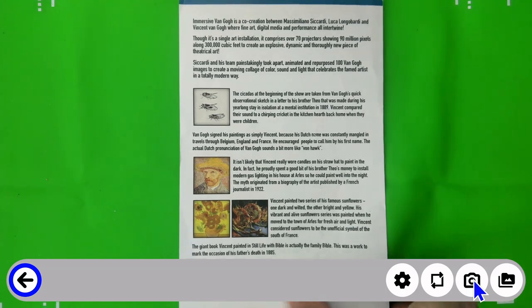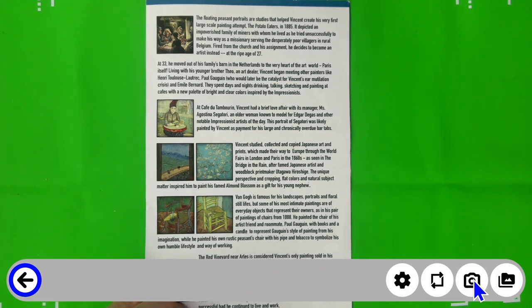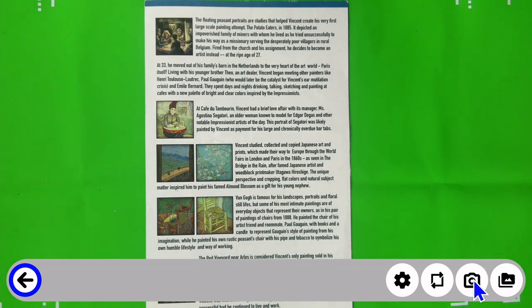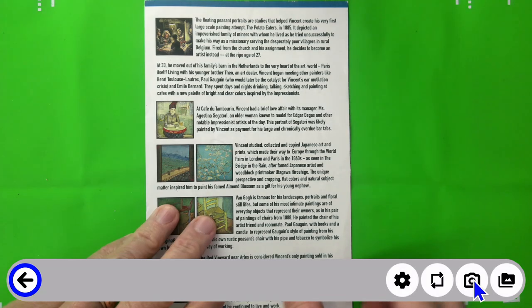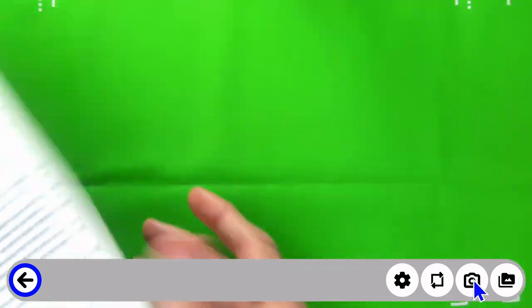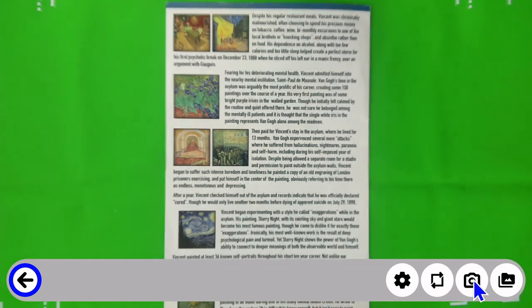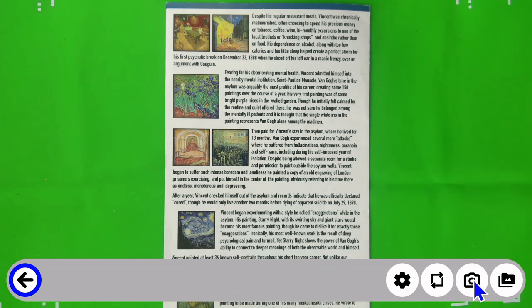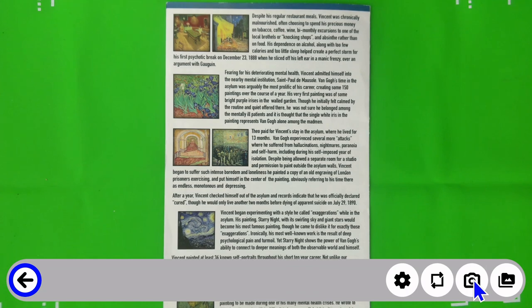So now it goes right back to live mode so that I can turn the page because we're doing multiple captures here. I'll rotate my page over and tap again, saving page two. So now let's go ahead and turn the page here and we will capture the last page that's in this document. So in this instance, we're not presenting the captured document on screen. So we cannot read it or do anything with it right now.